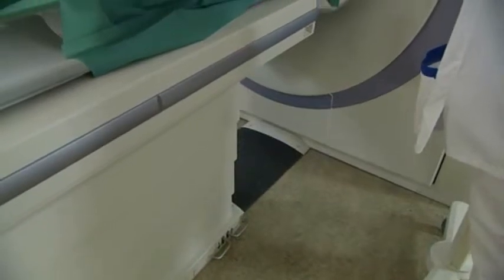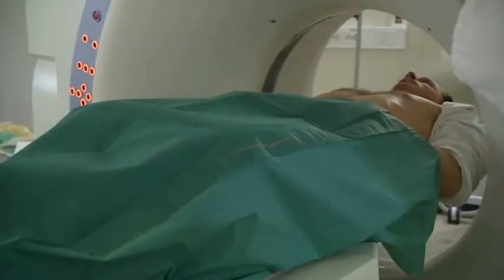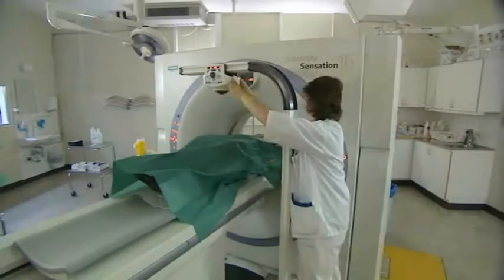Align the unit by slightly twisting the base with your ankle, keeping your foot firmly placed on the floor. The line laser should be parallel to either the edge of the table or the CT's midline laser marking.